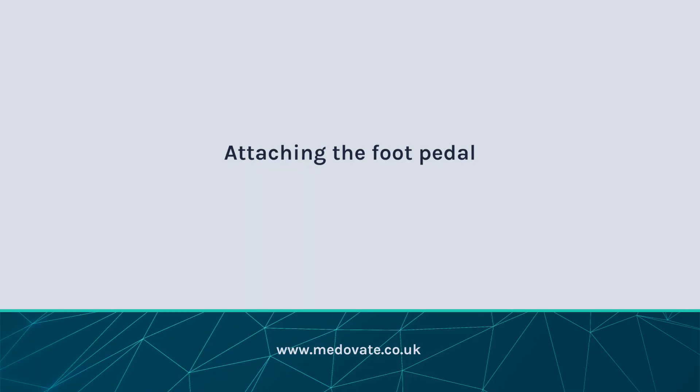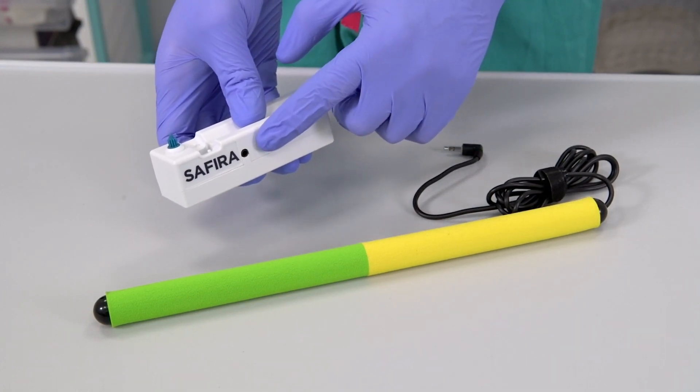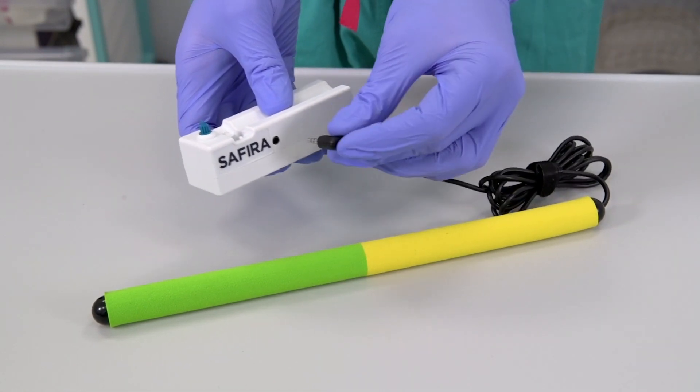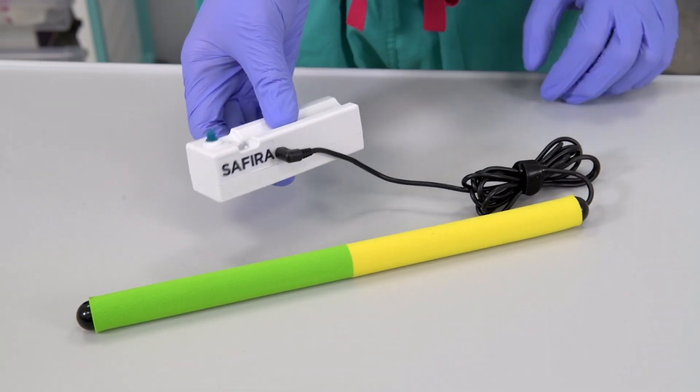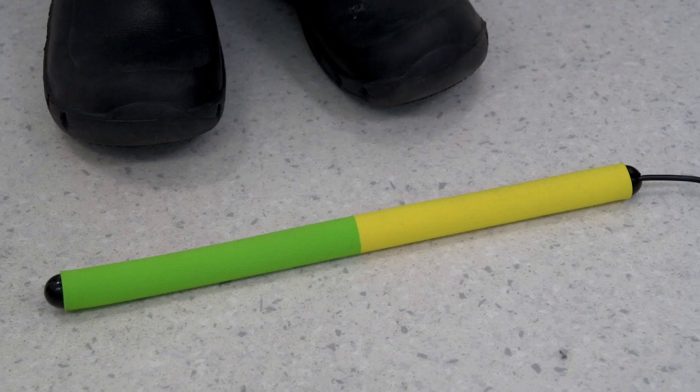Attaching the foot pedal operator. The plug end of the cord goes into the round socket opening on the side of the driver. Unwrap the cord if necessary and place the foot pedal in an appropriate and convenient position on the floor. The foot pedal has a yellow coloured end nearest the cable for aspiration, and a green coloured end furthest from the cable for infusion.